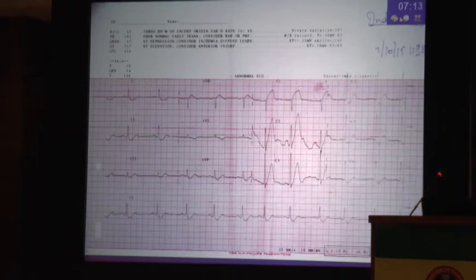So this is a patient who has a very acute proximal LAD block, and you can see there is ST depression in 2, 3, AVF. The basal leads are showing ST depression because the axis is going up. V5 is showing ST depression. So it's a proximal LAD because the basal leads are showing ST depression, the superior leads are showing you ST elevation. So you can tell by this very important parameter, otherwise this ECG doesn't look that dangerous. It looks rather kind of innocuous. I would not say innocuous, but not so bad an ECG of a patient who's going to have a bad prognosis.